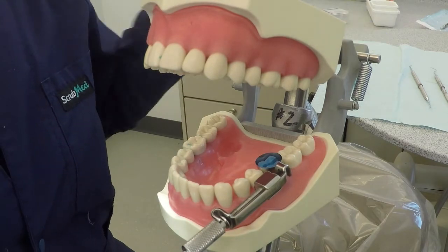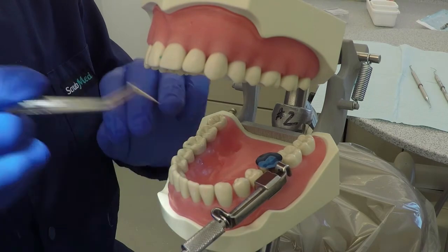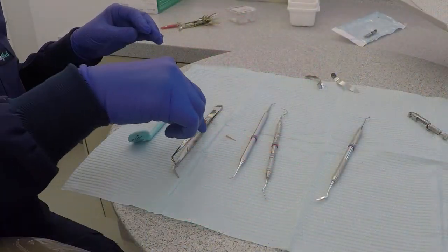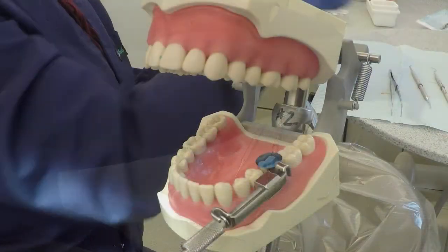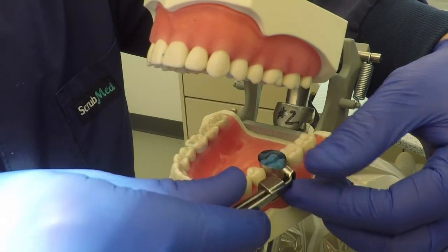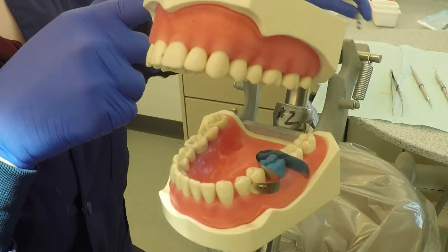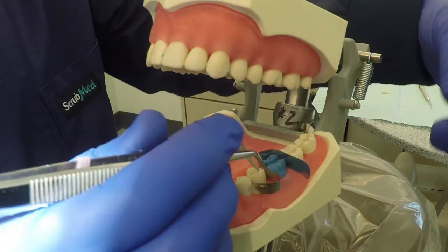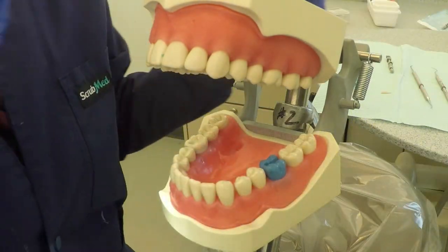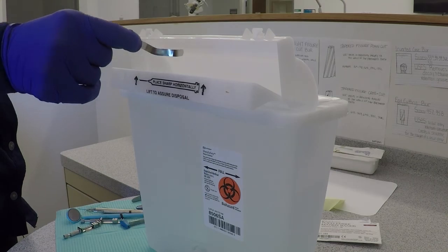At this point the amalgam procedure would take place and the matrix system is ready to be removed. Start by removing the wedge using the 110 pliers or Howe pliers. Hold the band securely in place while slowly turning the outer knob of the retainer counter-clockwise. Then use cotton pliers to carefully spread open the ends of the matrix band and lift the matrix band using a seesaw motion. Make sure to discard the used matrix band in the sharps container.